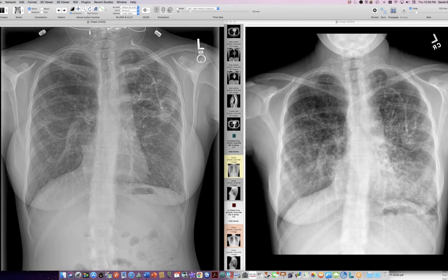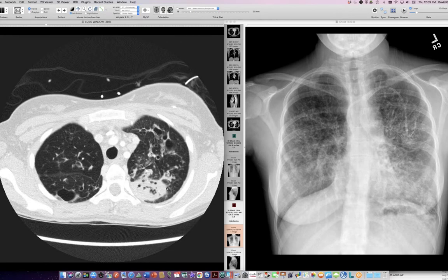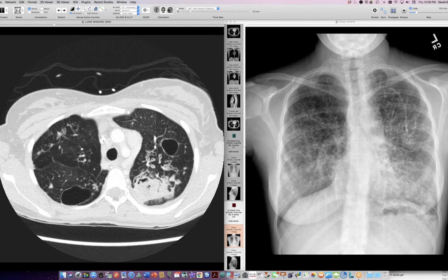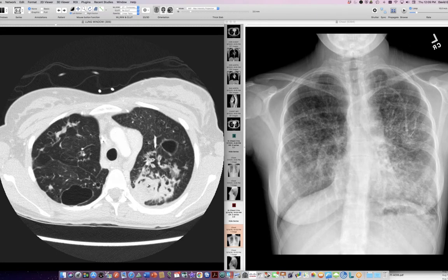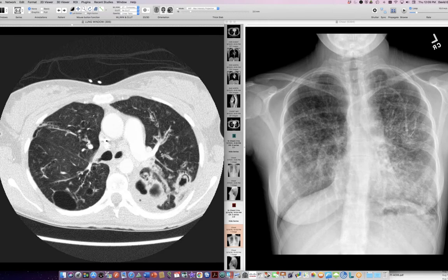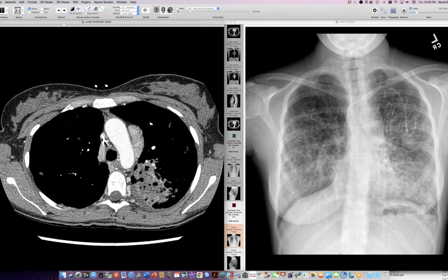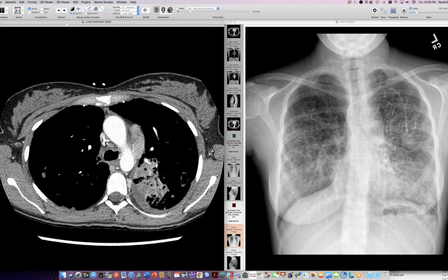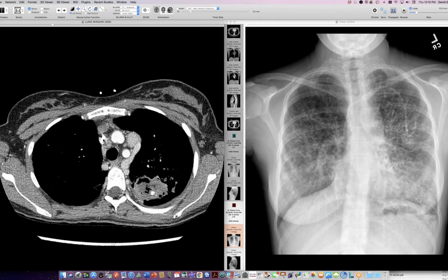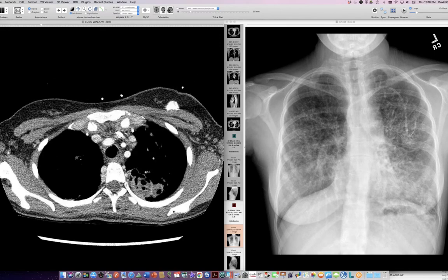I don't have a radiograph to show you that, but I can show you what her CT in September looks like. And you can see that she's now filled in that big cavity that was lurking at the level of the aortic arch. She has some other cavities here. She's got some Aspergillus mycetomas in some of these cavities. You can see a very nice mycetoma out here. And if we look on a soft tissue window, we can see that the reason that she's hemoptysizing is that she has this pseudoaneurysm up here.